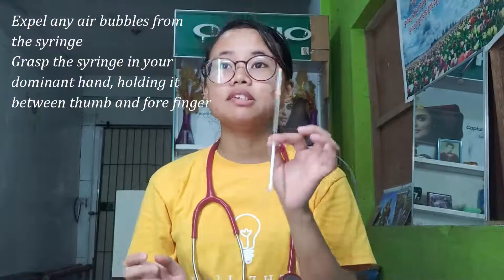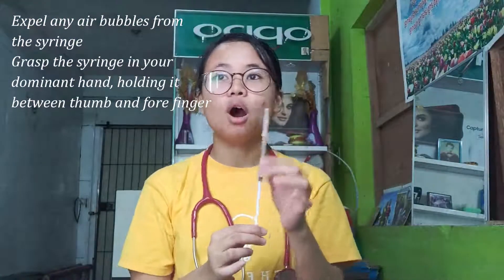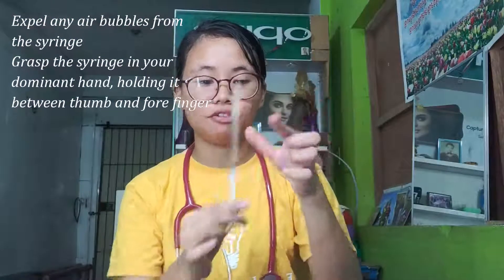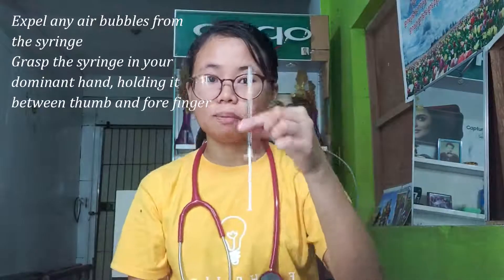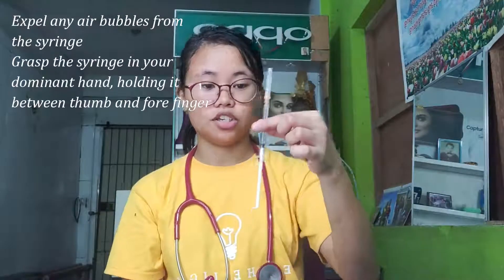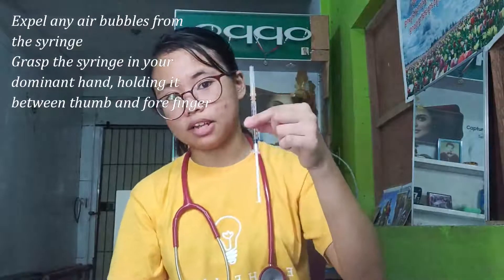Grasp the syringe in your dominant hand, holding it between your thumb and forefinger. This is how you hold it when administering an intradermal injection.